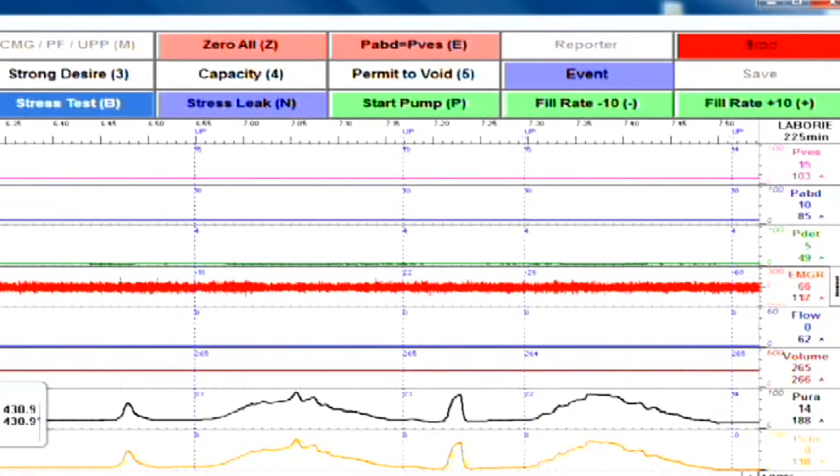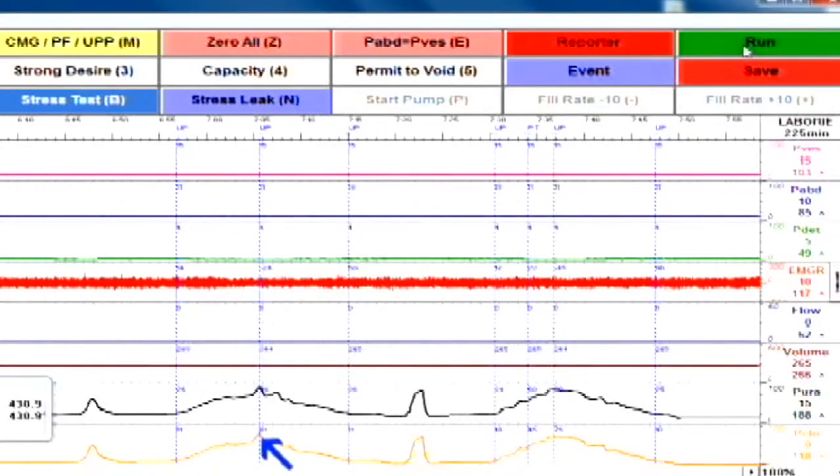Once you hit Stop, note that the peaks or the maximum urethral closure pressure will be automatically marked. If you have questions about setting up a UPP study on your GOBI, please refer to the Owner's Manual or contact Laborie.